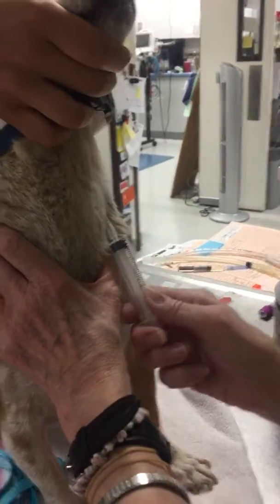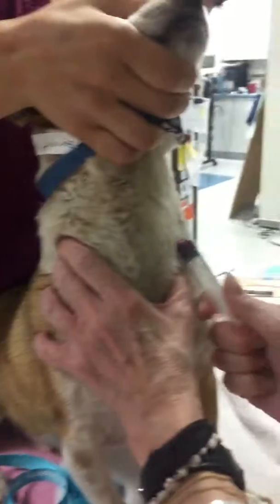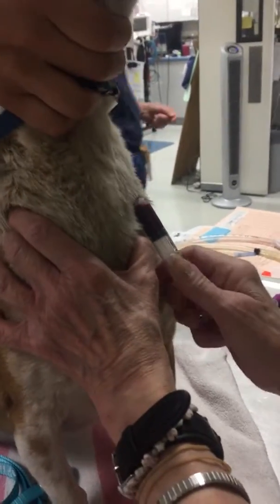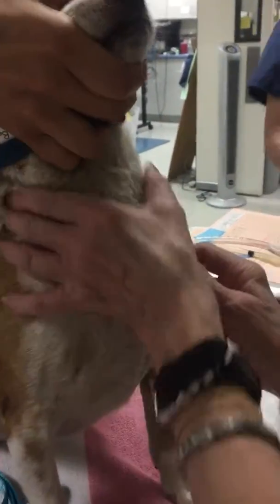I have to get this. We're doing the blood draw for the activated coagulation test and it goes straight into the tube.